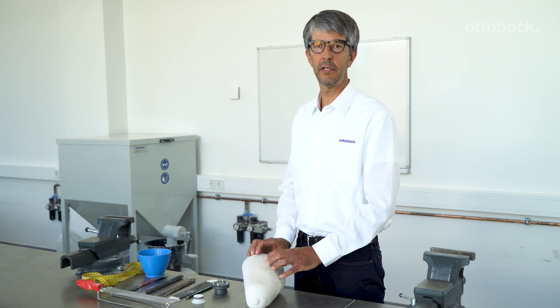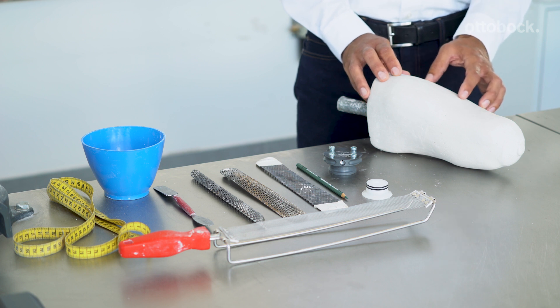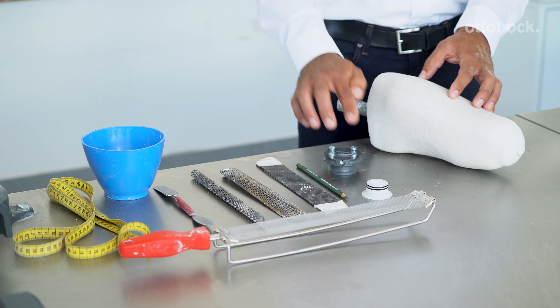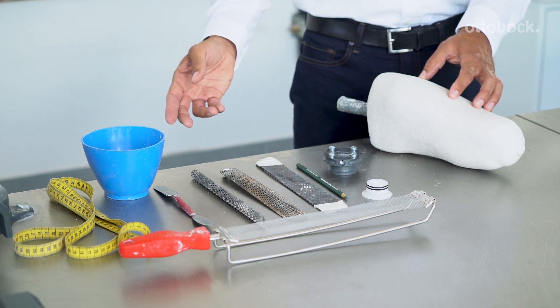Hello. In this video we will show you what you need to know when plaster casting and modifying the cast for the DVS. The following materials and tools are needed: the plaster cast, the DVS piston dummy, the DVS housing, and the plaster rectification tools.